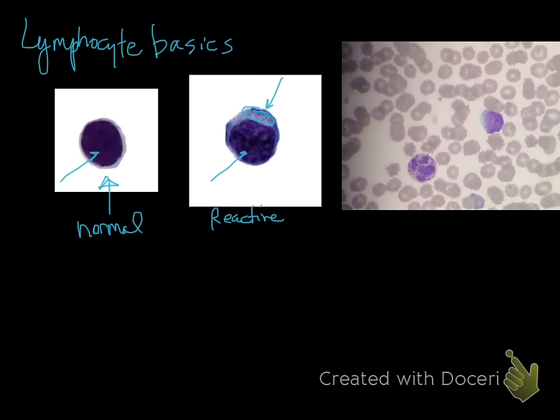In general, small lymphocytes are going to be smaller than a neutrophil, so this is actually a neutrophil, and there's something wrong with this animal. And here's a lymphocyte, and you know when you're a clinical pathologist when you only have pictures on your iPhone of cells that you see while you're on duty.